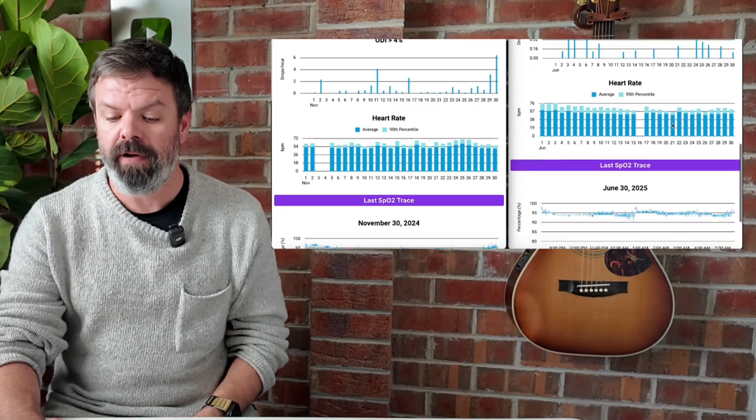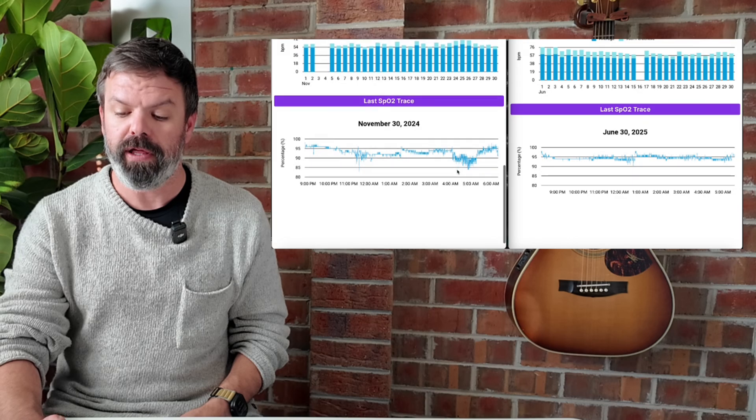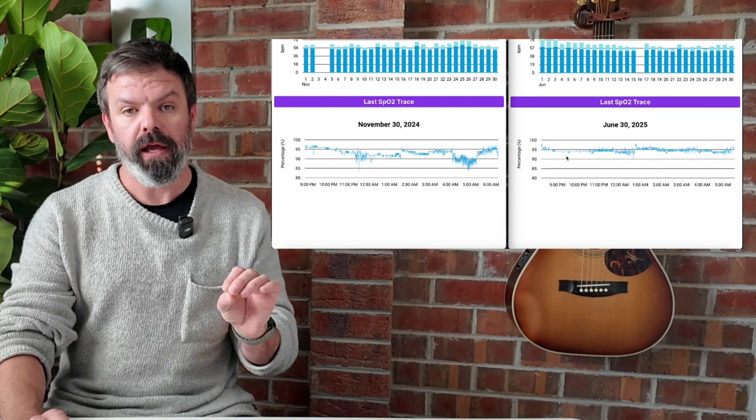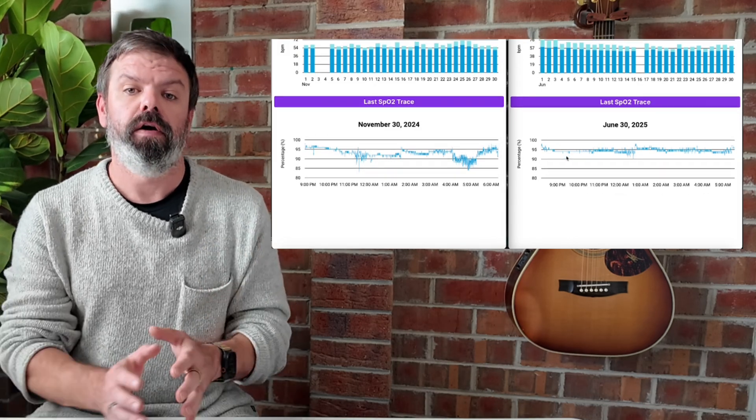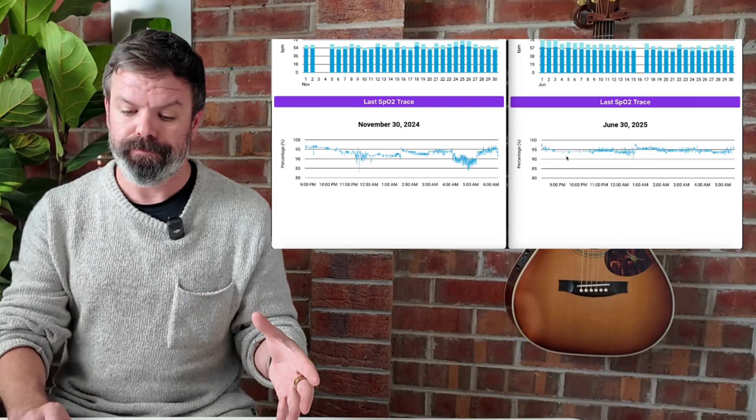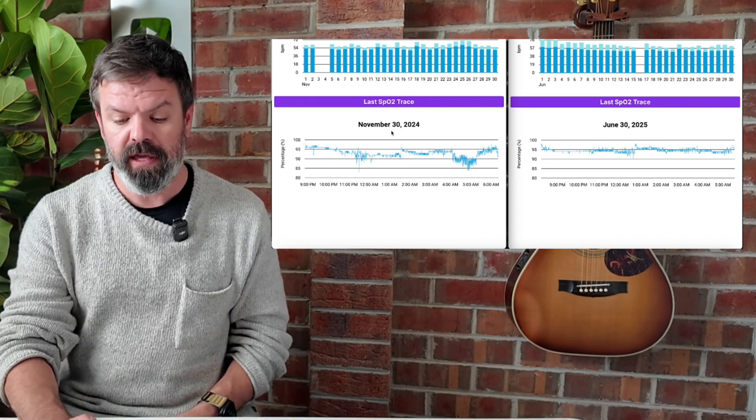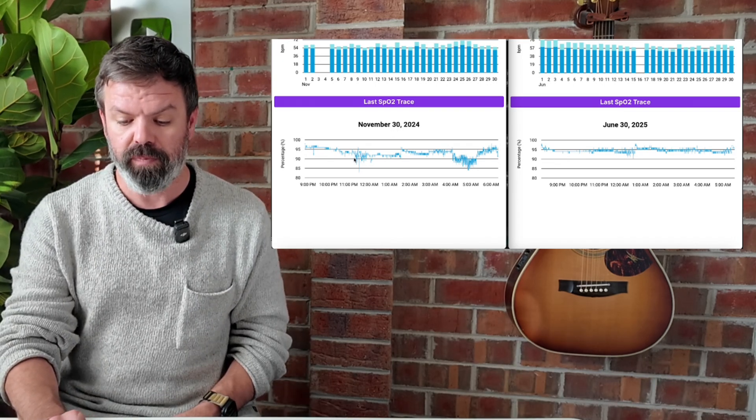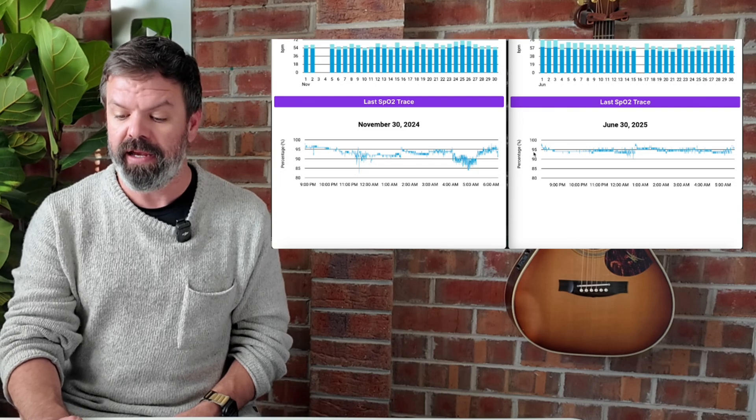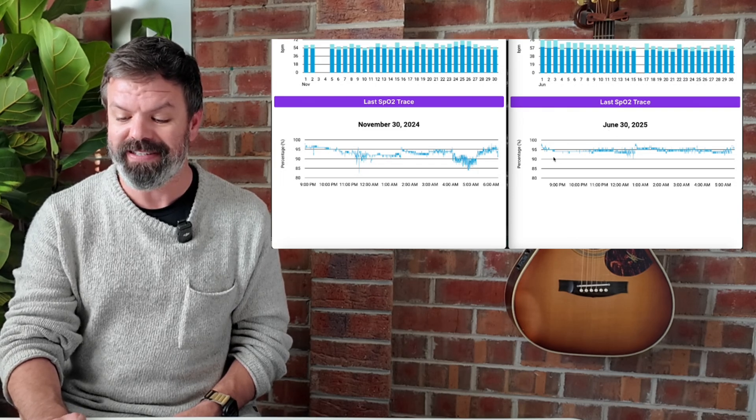Then we have our heart rate. And then we also include the last recorded SpO2 trace from the report. So this is November 30th here. That's what it looked like. Lots of big drops here. And then here is June 30th. Nice and stable.